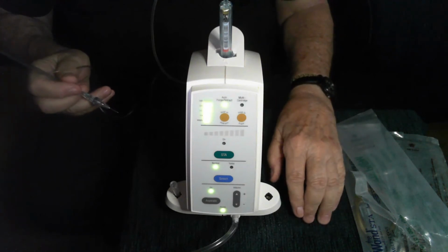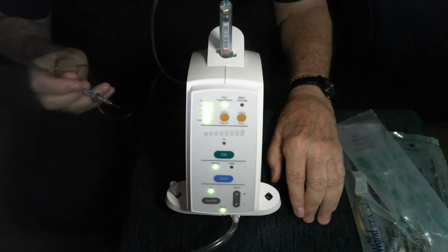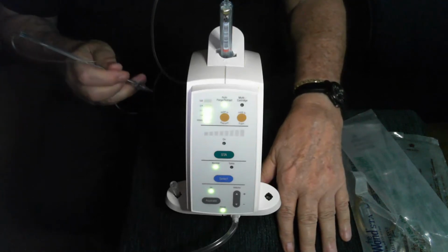So during an infiltration or during a mandibular block, whenever we're in tissue that can expand, not dense tissue like in the palate or the sulcus of the tooth, but expandable tissue, I can go to the faster flow rate by depressing the foot pedal all the way down.